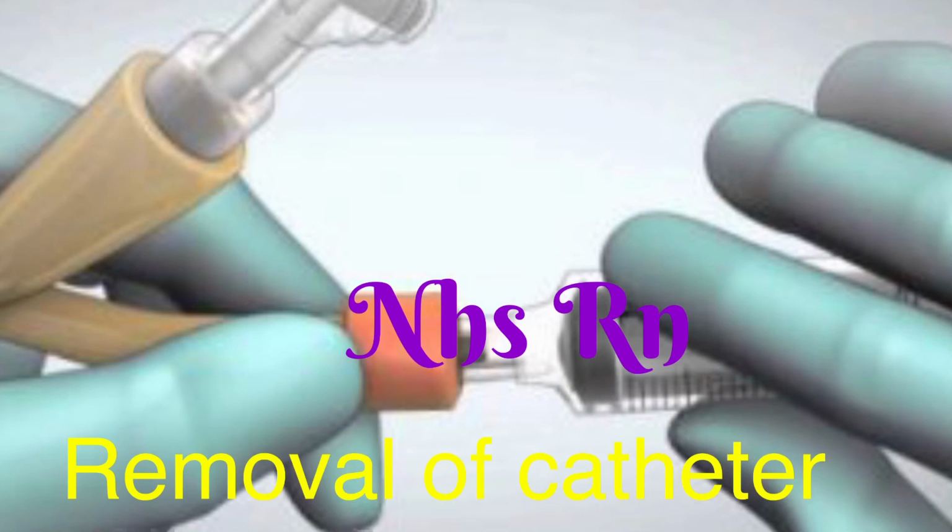Okay, then you need to empty the catheter balloon, always with a 10 ml syringe, and remove the water from the balloon with the syringe, that is usually 10 ml. Then remove it, and at that time it will deflate.